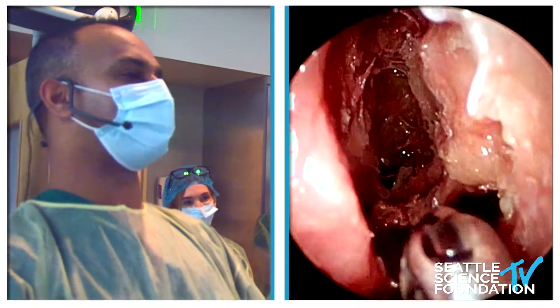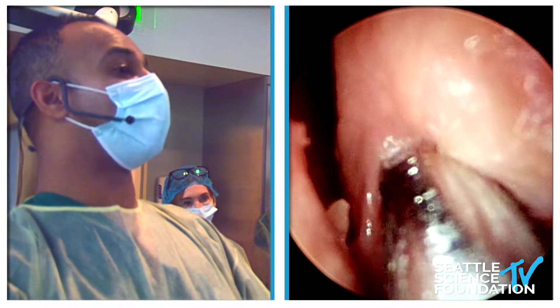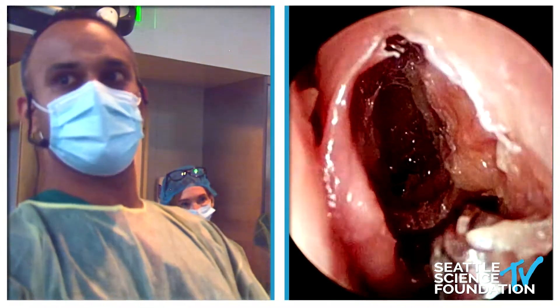Here's where I was talking about if you want to do something anteriorly at the armpit. And we could talk about fancy axillary flaps, but really all I want to do is switch over to the angled scope.